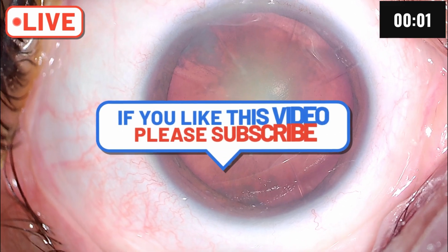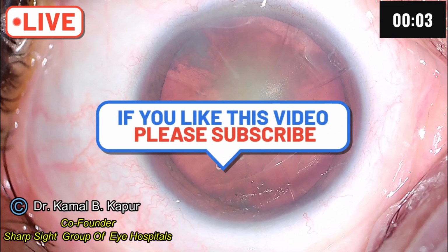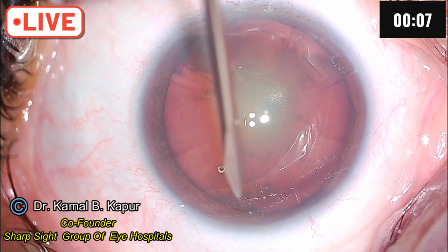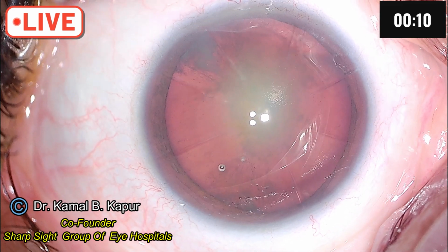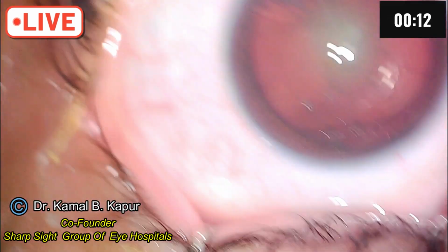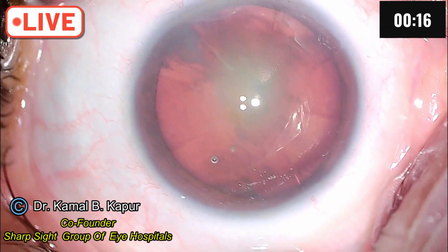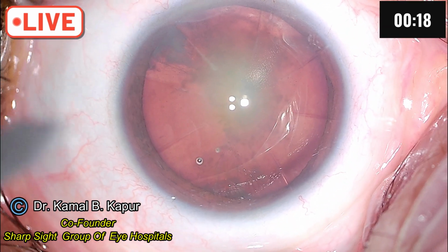This is a case of post-RK, and let us count the number of cuts. 1, 2, 3, 4, 5, 6, 7, 8. So, when you have 6 to 8 cuts, you can have a limbal approach. The only thing here is to identify which should be your entry area.